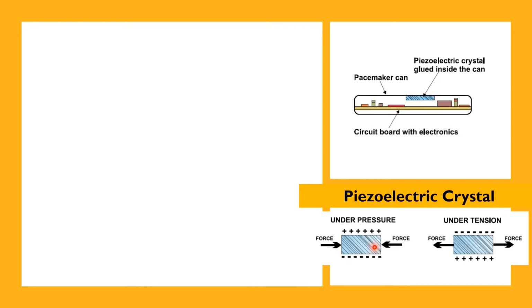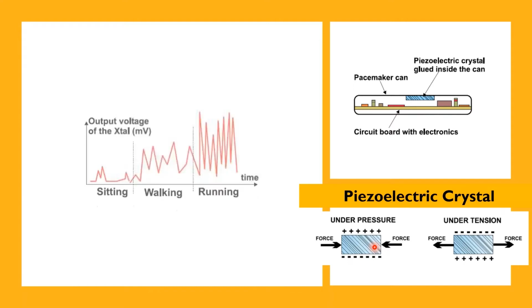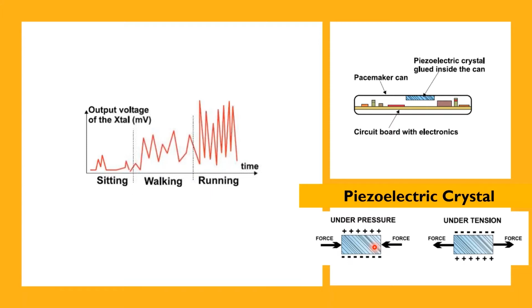The core reason behind it is these piezoelectric crystals. Whenever there is any mechanical stress along them, they generate voltages and output. This voltage output is then placed as an input to the pacemaker, the pulse generator itself, and of course generates various different outputs based on the activities.